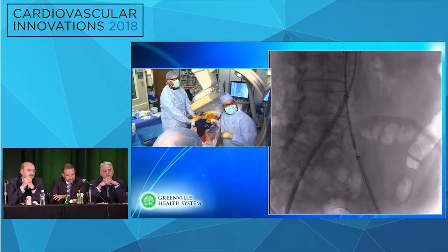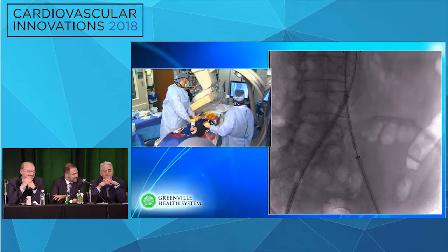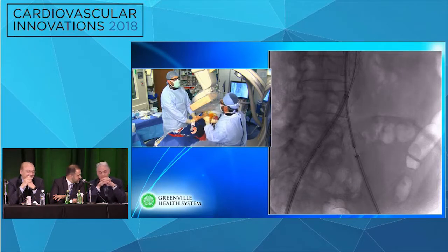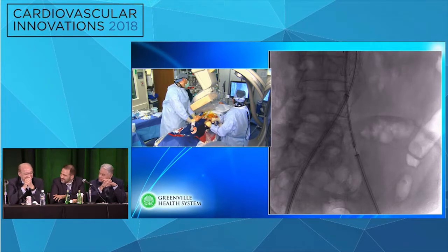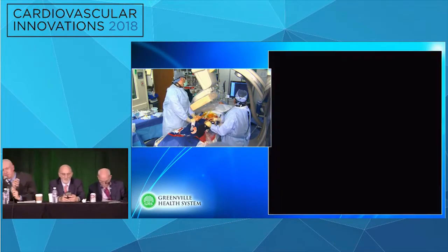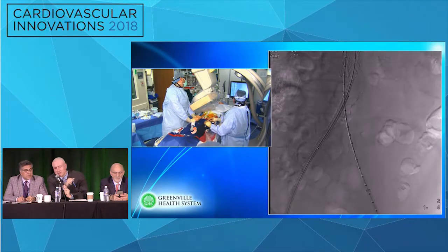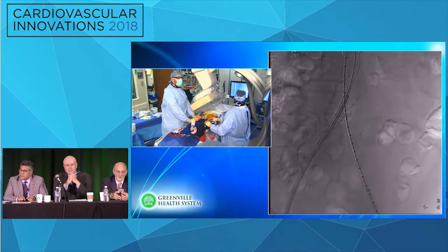She marked the wrong screen. For those of you that don't do a lot of this, it's also extremely helpful to mark your iliac crest, because invariably somebody's going to move the table and it's hard to make an angiogram and find your hypo. I think they'll do it again.